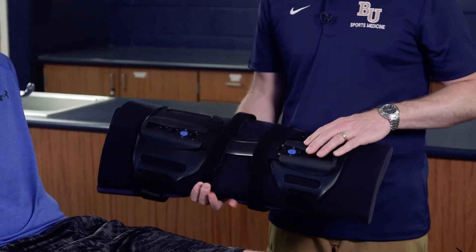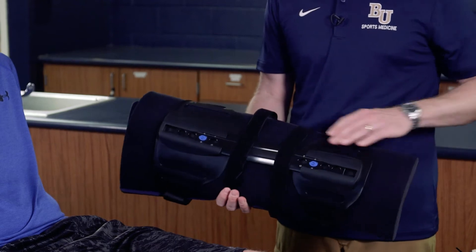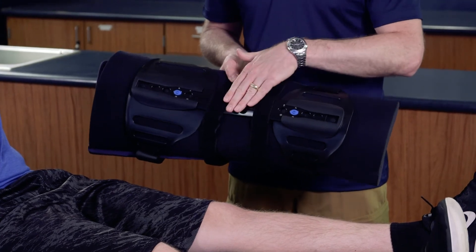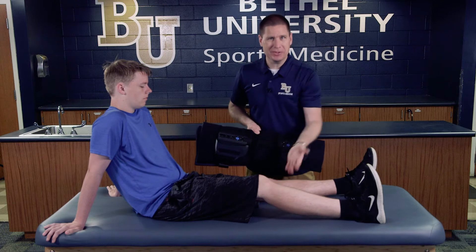I've set it at what's called a medium setting, which is going to be appropriate for his particular leg. One of the big features to note is that the back of the knee immobilizer has a little bit of a curve, and that's going to go directly behind the popliteal space of the knee.